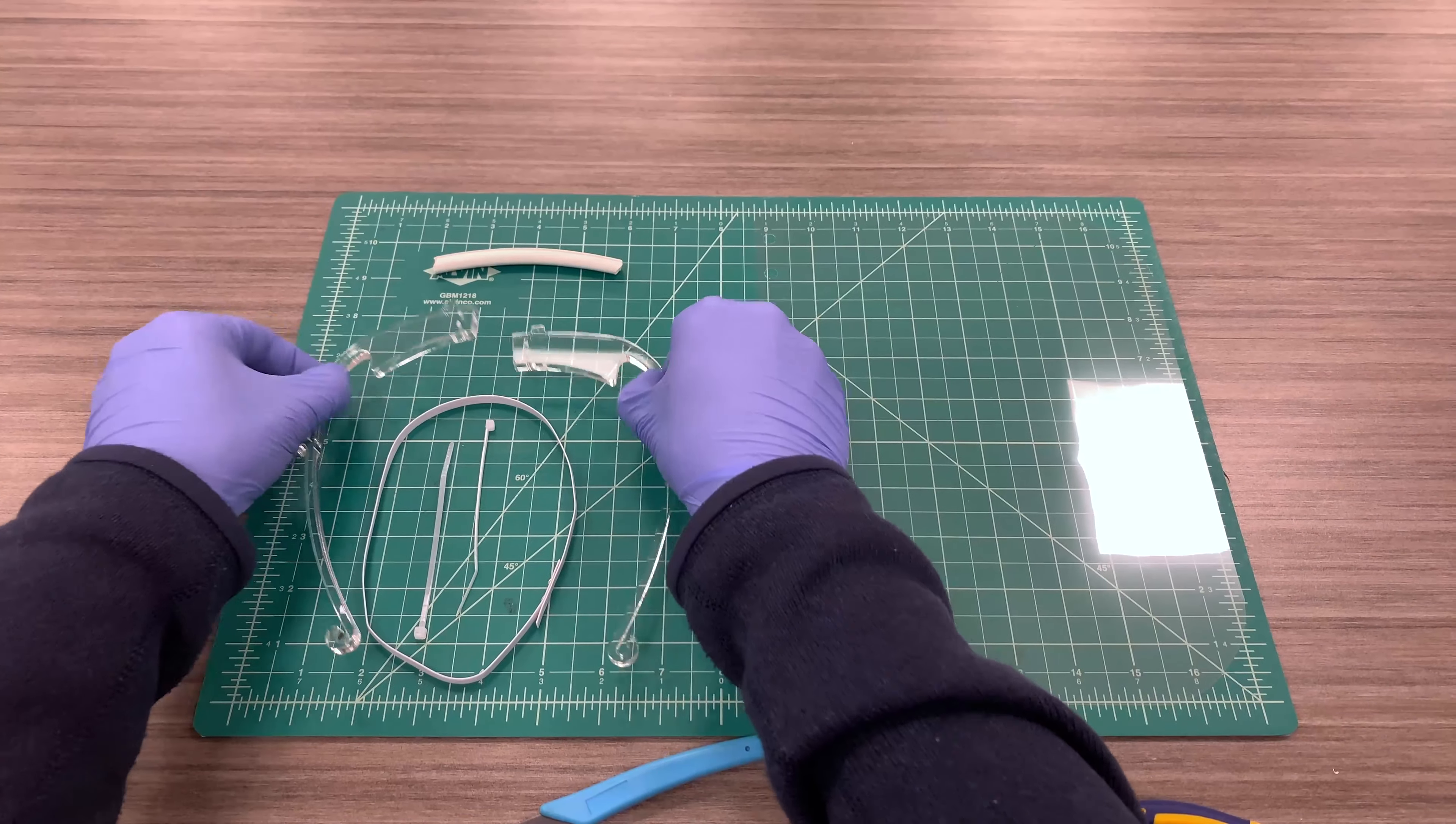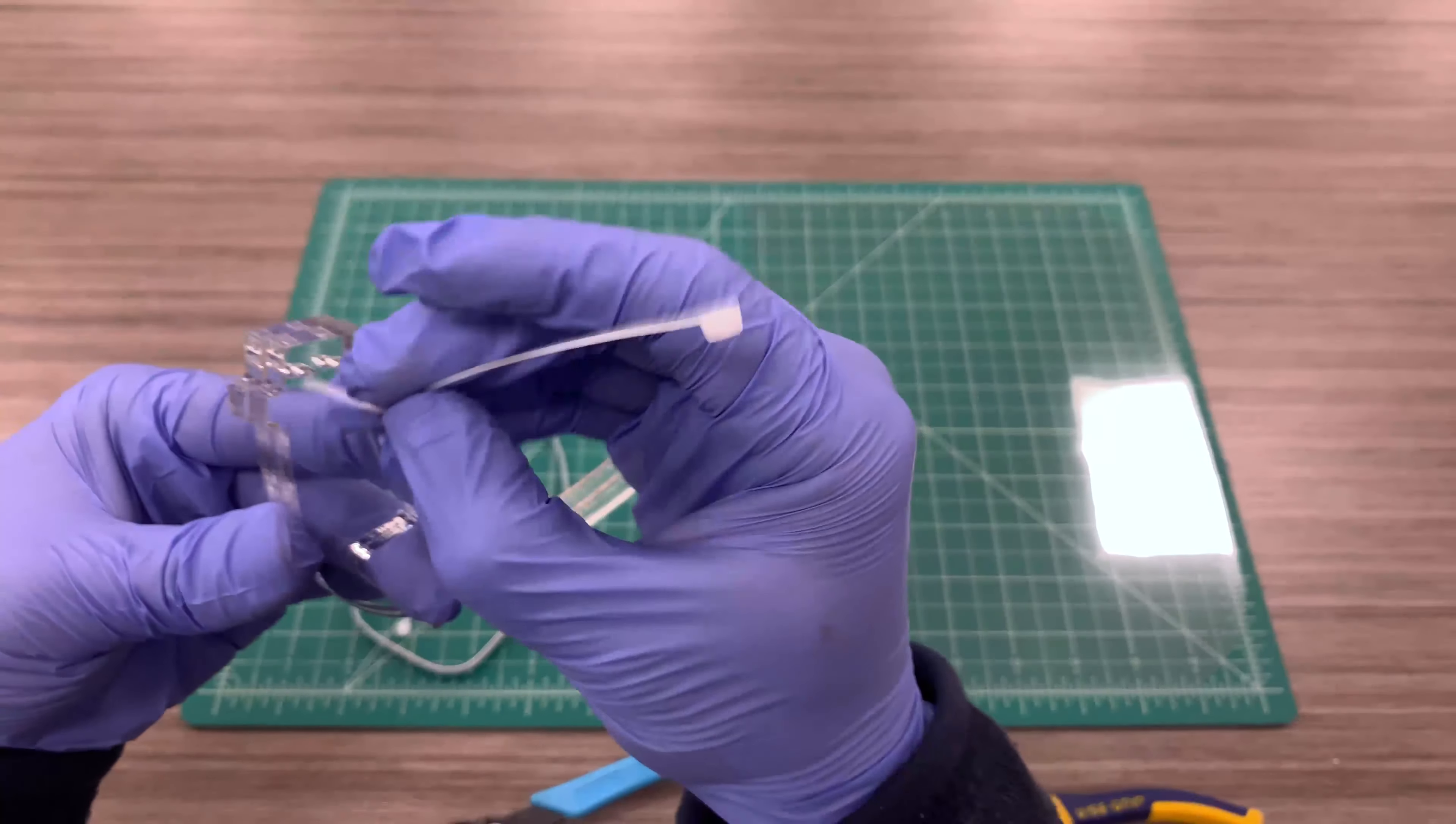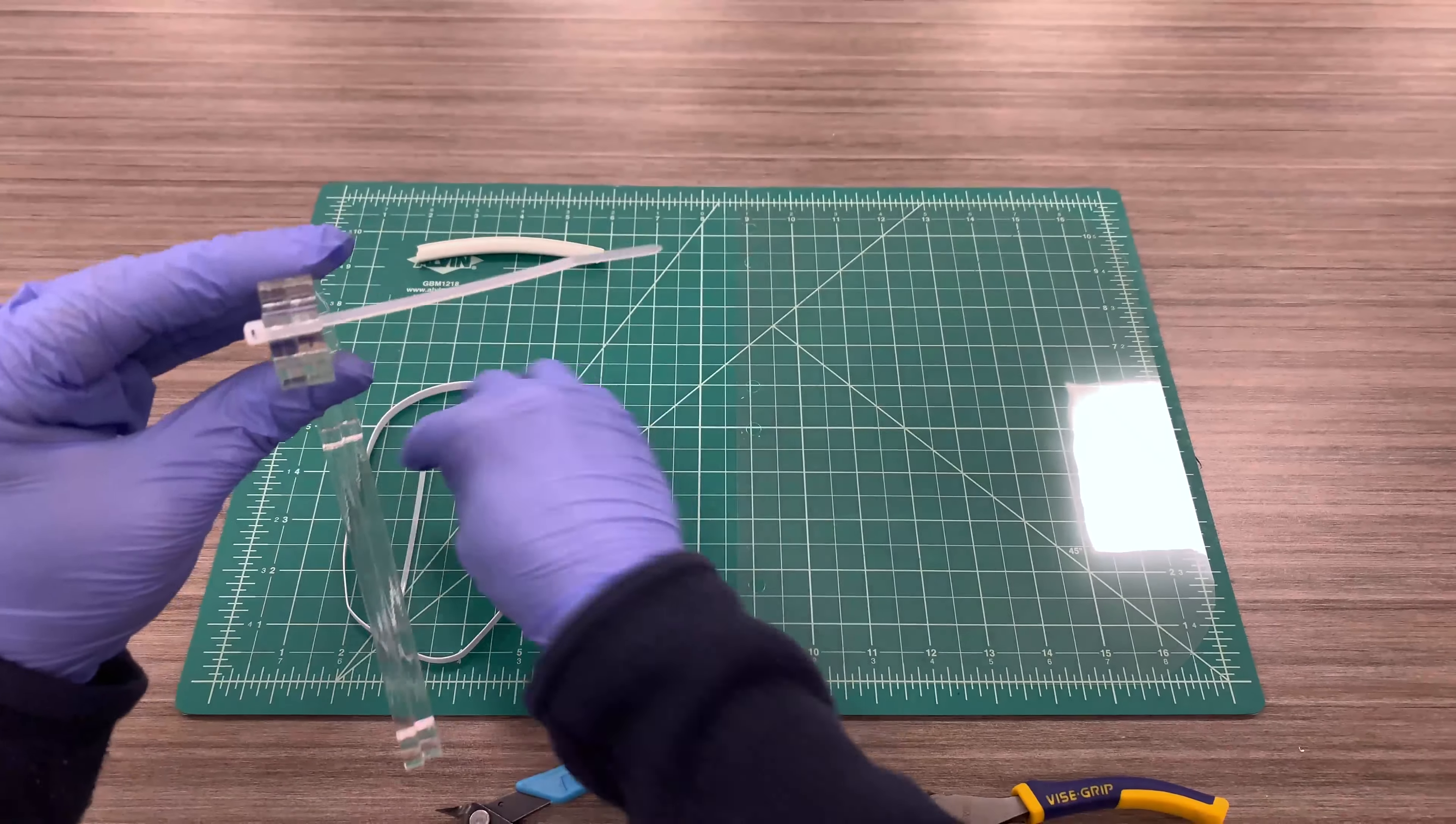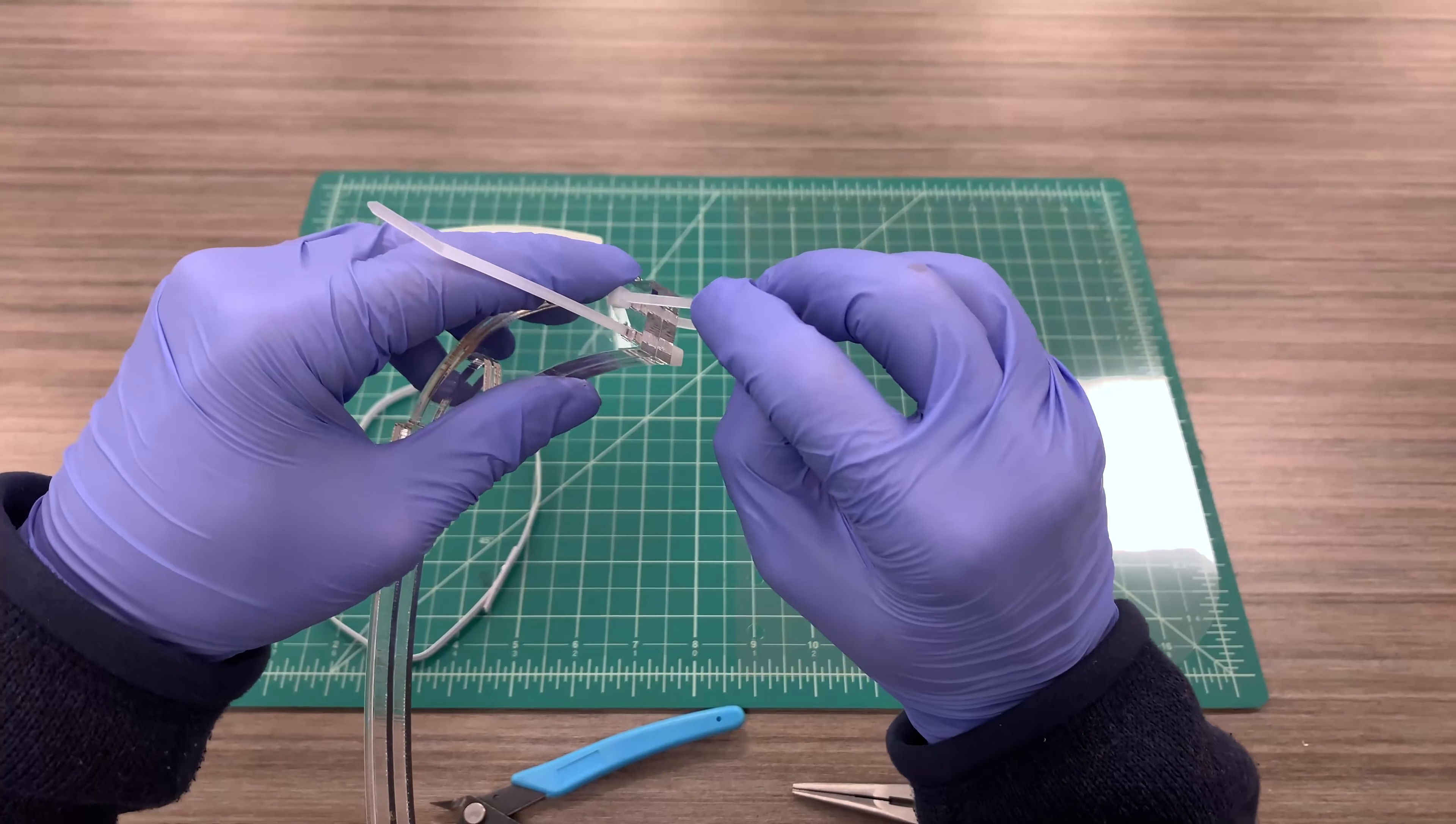All right, so we're gonna assemble the visor first. It's two symmetrical pieces. You want to overlap. You take one zip tie, feed it through the top. The other zip tie, you want to feed it the opposite way through the other hole, and you want to close them slightly.